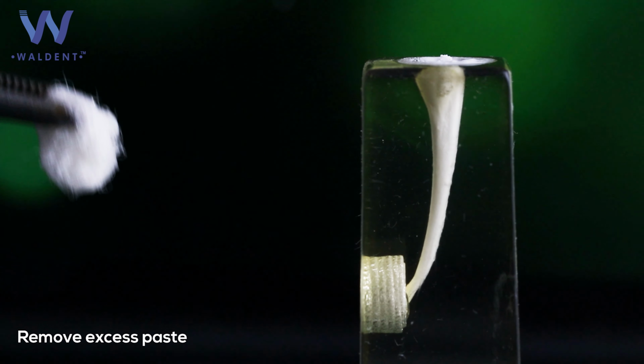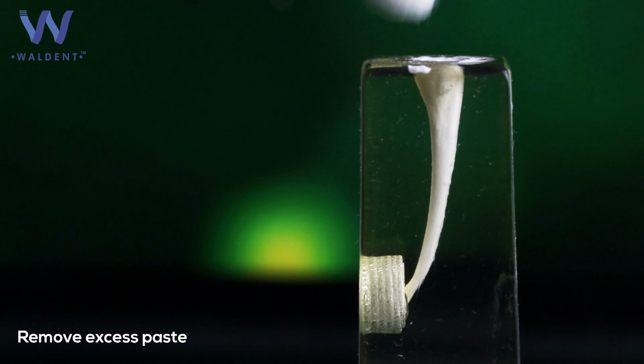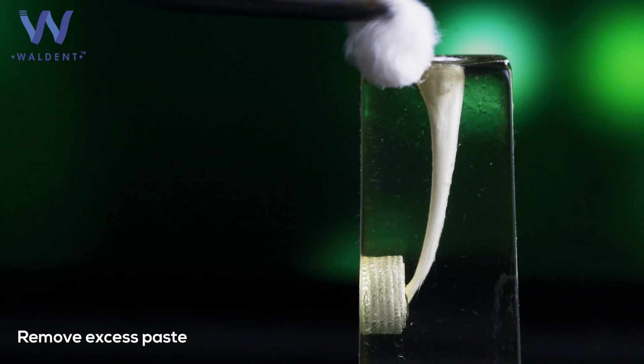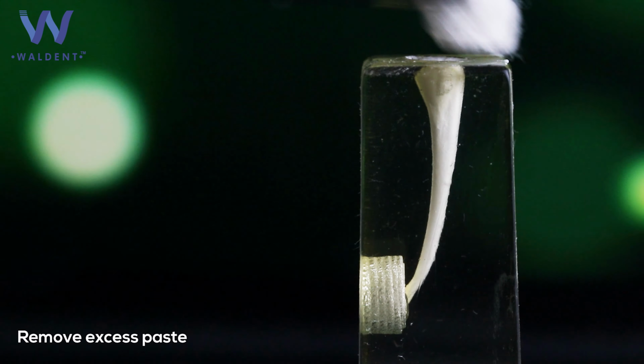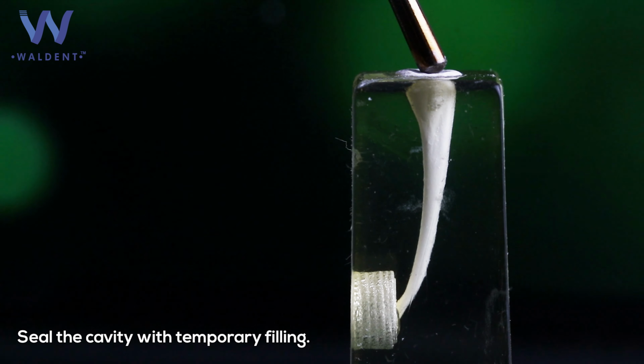Remove the excess calcium hydroxide paste with the help of a sterile cotton swab. Finally, seal the access cavity with temporary filling until the next appointment.